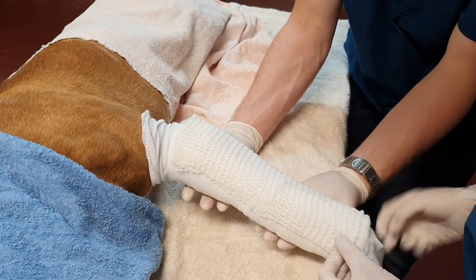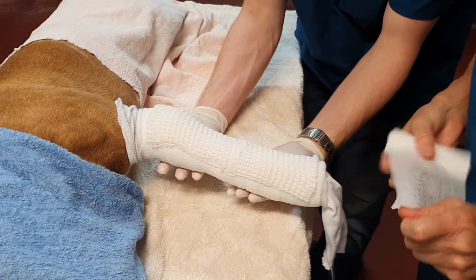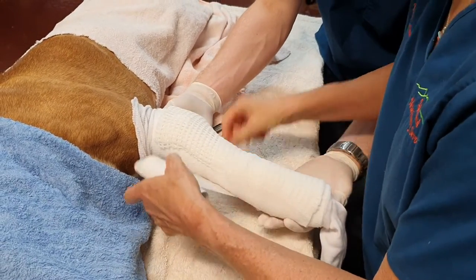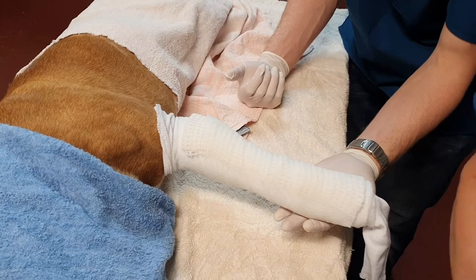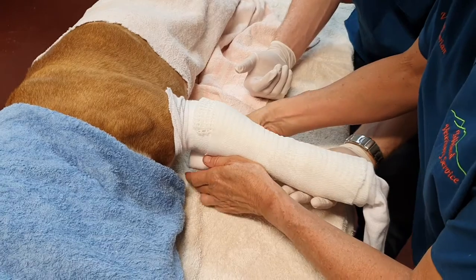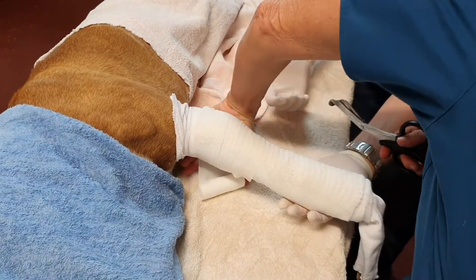This one's a little bit short — I want it down just a few millimeters above where the padding is. I'll take my gloves off and come back over with another layer of conforming to mold that splint while it's still soft to the shape of this individual's leg. At this point just reiterate — we want to be very careful that we don't put thumb prints or anything in here that might put a pressure sore on the splint. Don't need a lot — it just needs to hold it in place and mold that splint so it fits nicely to the shape of this individual.